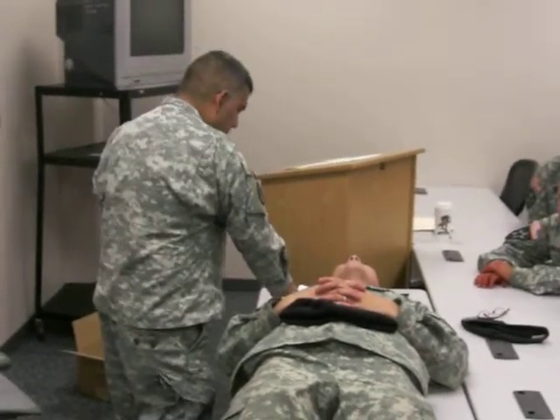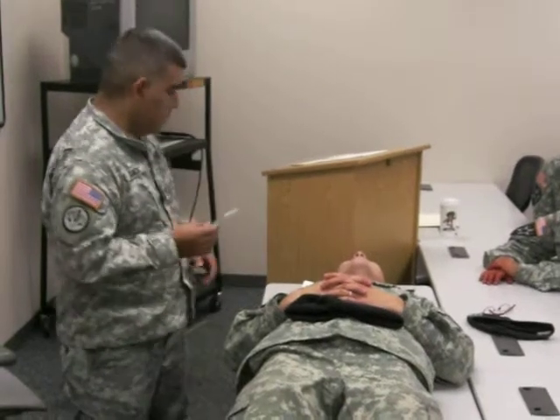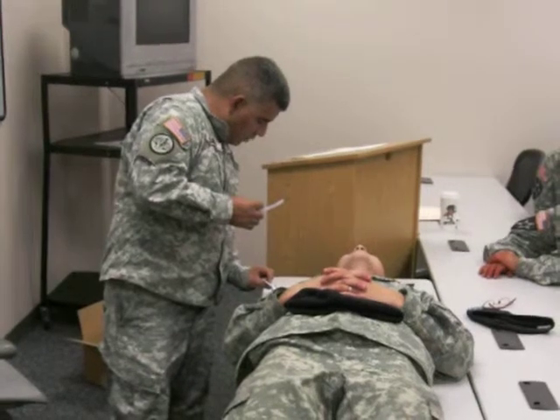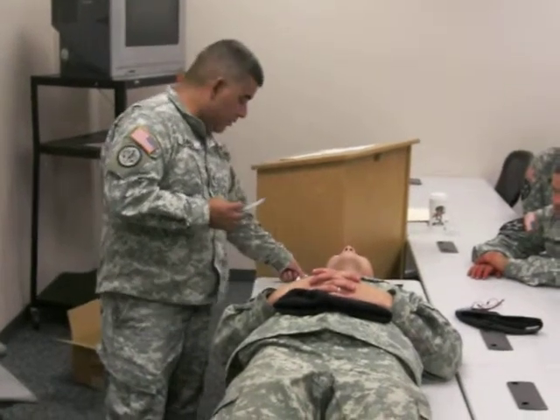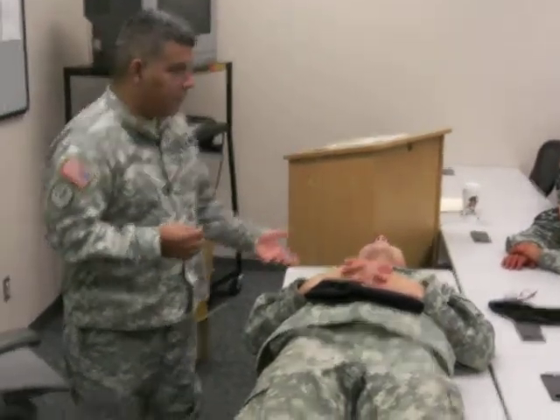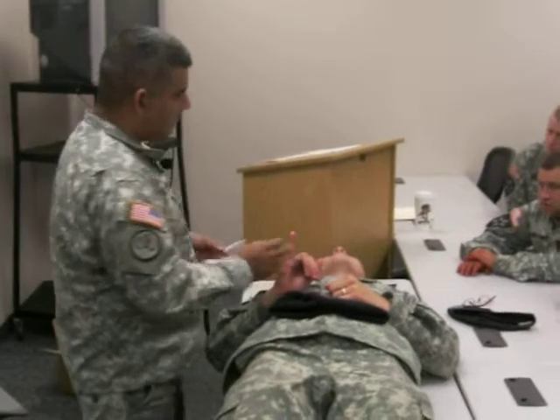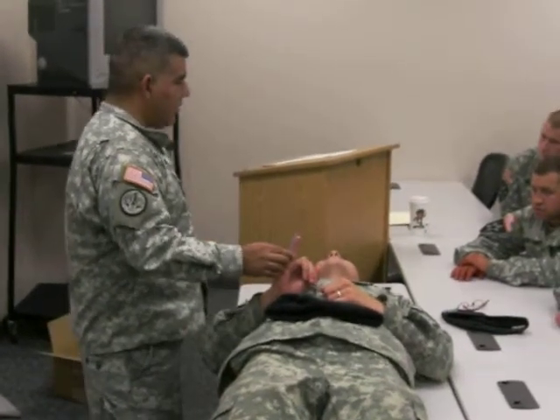They come in different sizes. Normally it's going to be about 9 millimeters. This one right here is 9.4 millimeters. If you look on the front of the package, it'll tell you what size. To size it, we're going to look at the little finger on the casualty. It should be either that size or smaller.